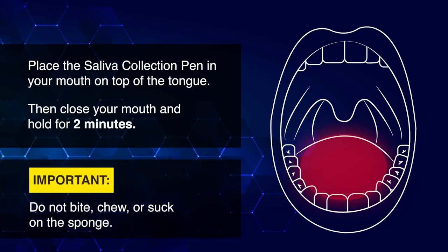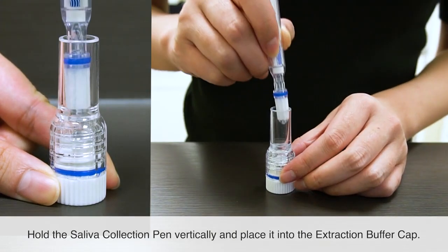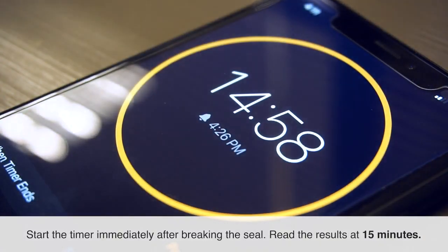Do not bite, chew, or suck on the sponge. Hold the saliva collection pen vertically and place it into the extraction buffer cap. Press down to break the seal of the buffer cap, releasing the buffer solution. Start the timer immediately after breaking the seal. Read the results at 15 minutes.